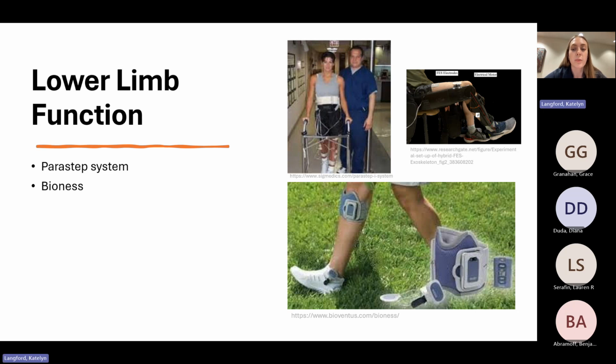I wanted to bring up some drawbacks to these, and a lot of that has to do with muscle fatigue and the control of joint trajectories, where patients are really easily fatigable, especially when they've been chronically ill with a spinal cord injury in the ICU for weeks, if they're a polytrauma, things like that. There's also no implantable systems that are available commercially in the United States. They are approved in Europe, though. I wasn't able to find one that has been recently available in the US. I think the papers that I was reading, as of like 2018, there wasn't an implantable one on the market.